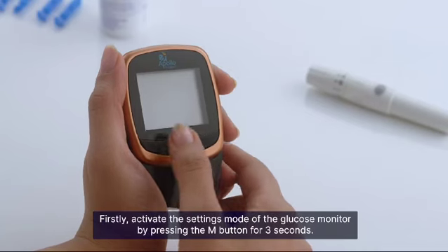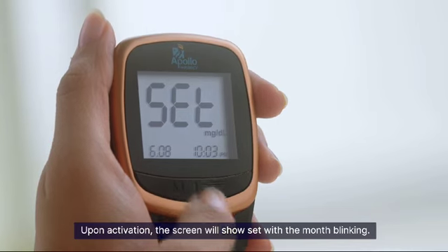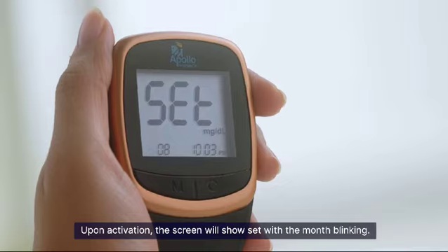Firstly, activate the settings mode of the glucose monitor by pressing the M button for 3 seconds. Upon activation, the screen will show 'set' with the month blinking.